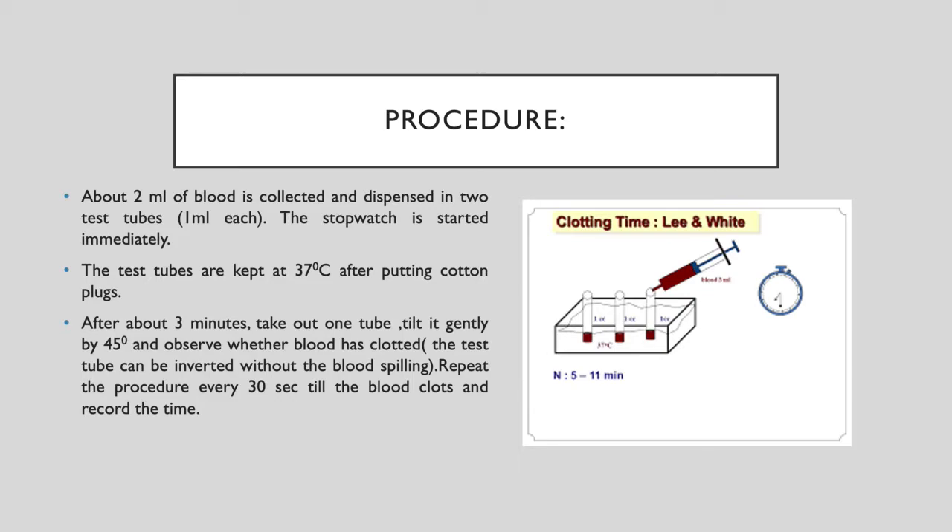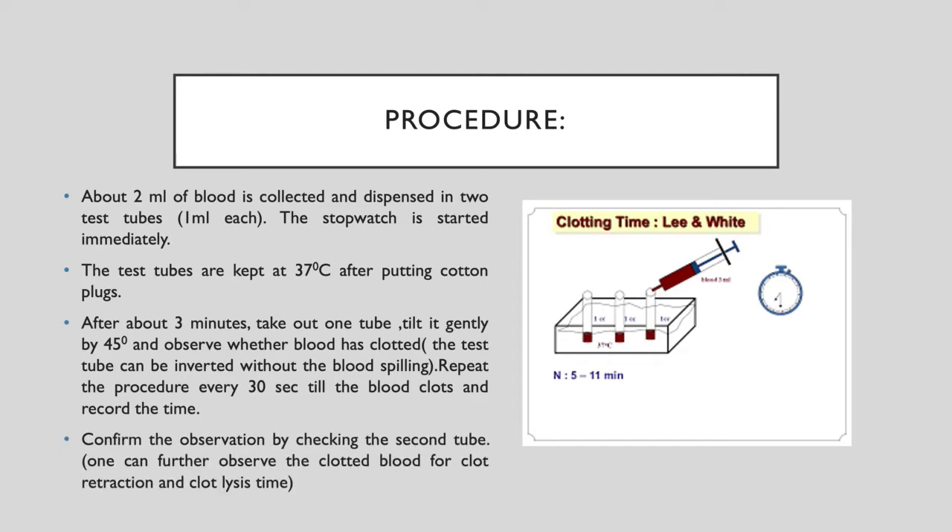After about 3 minutes, take out one tube and tilt it gently at a 45-degree angle to observe whether the blood has clotted or not. Repeat this procedure every 30 seconds until the blood clots and record the total time. Confirm the observation by checking the second tube as well. You can also continue to observe the clotted blood for clot retraction or clot lysis time.